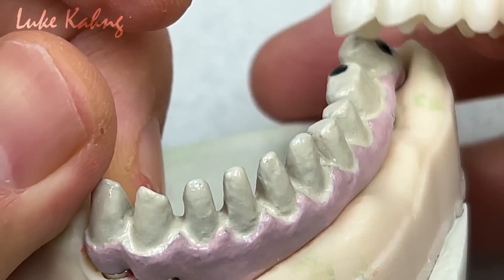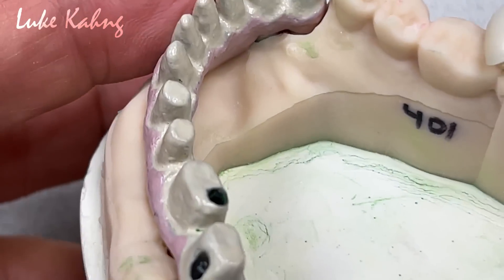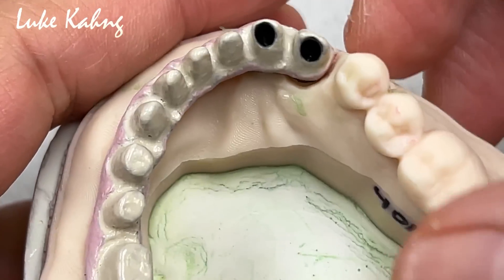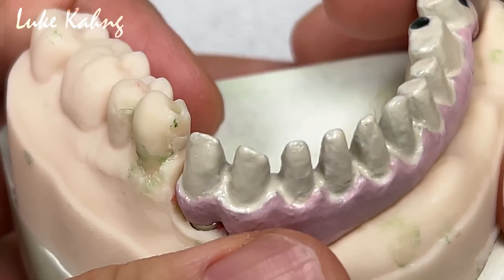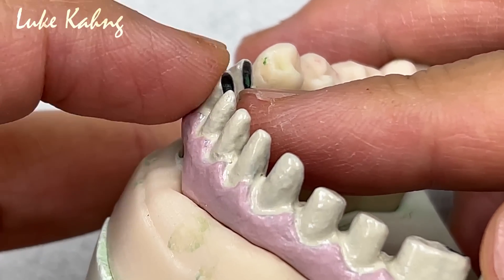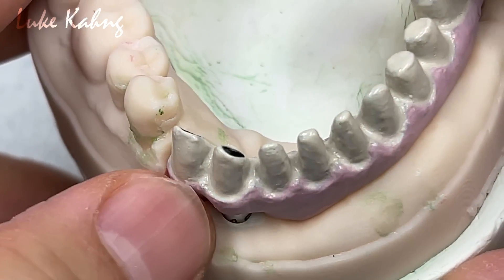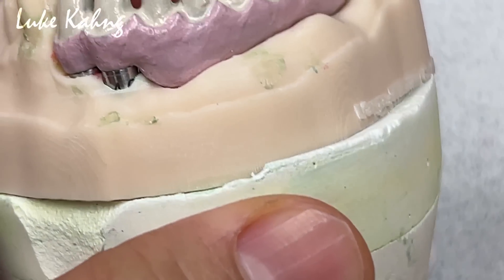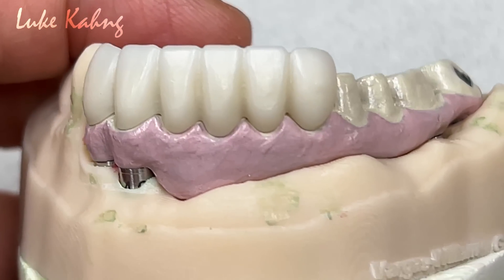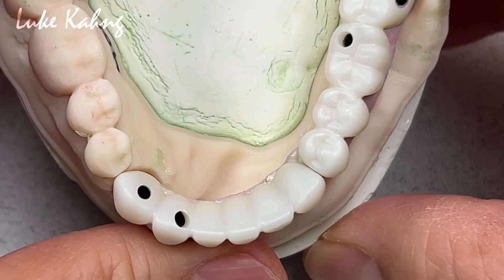After we opaque, you saw the old grind — trying to bring in the facials slightly more. We made the angle screw channel 25 degrees UCLA, finished it, and now made it as minimum thickness as possible. Due to the heavy bite, we made the two-piece monolithic zirconia — going to make a little bit better color than PMMA, much better.